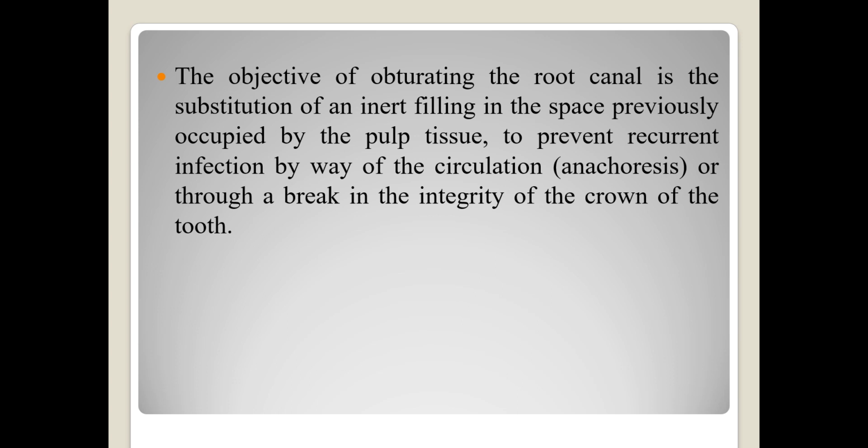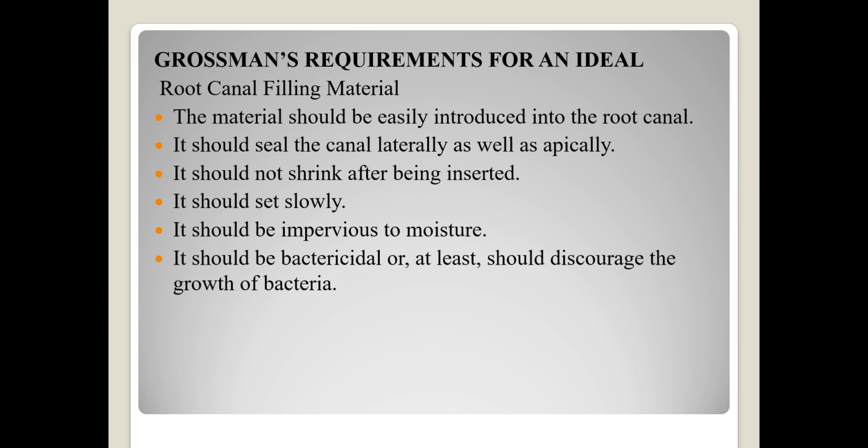The objective of obturating the root canal is the substitution of an inert filling in the space previously occupied by the pulp tissue, to prevent recurring infection by way of the circulation or through a break in the integrity of the crown of the tooth.